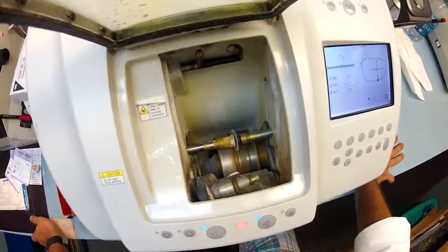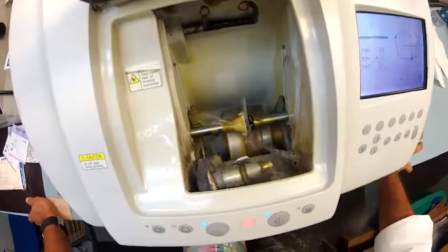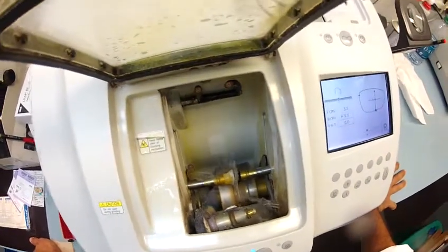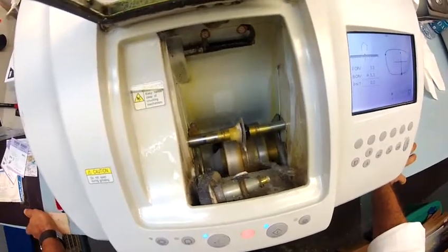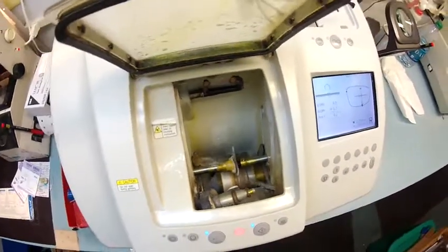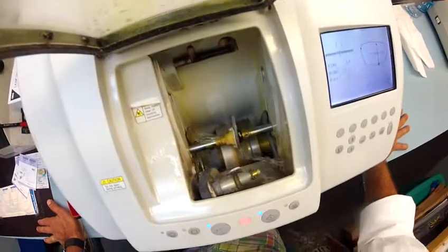So you do get the thinner, lighter weight lenses, virtually unbreakable, bulletproof up to 22 caliber, both UVA, UVB protection, and an anti-glare coating to eliminate glare when driving at night, particularly driving at night in the rain. Now, if you notice, these water jets have just kicked in. Up until now, polycarbonate cuts dry. There has been water running in the background, but it does this in the last 20 seconds just to wash away any optical debris. In just a moment, I'll take your lens out and we'll see if it fits into the frame.